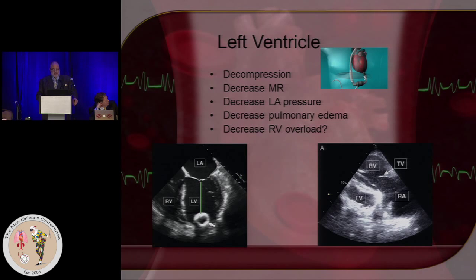Because the RV has to be nursed through both perioperatively as well as long-term. On the left-hand diagram, you see the cannula, and it's sitting opposite the mitral valve, and that's probably a relatively good filling state of the left ventricle. You want to see a more or less neutral position of the septum, perhaps bowing slightly into the right.